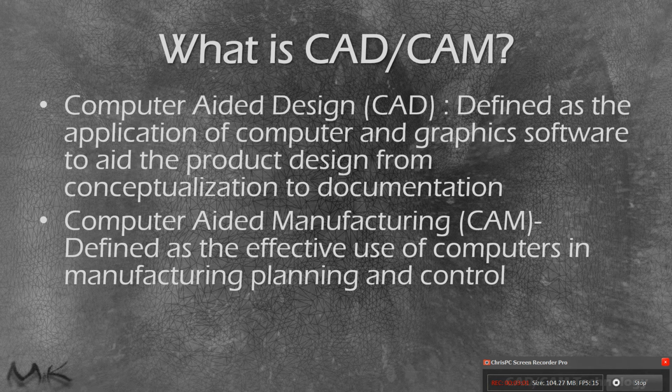So it can happen in two different ways, right? We can have additive and subtractive methods. When we look at our subtractive methods of CAD/CAM, that's more along the lines of our in-office milled restorations. When we start looking at additive types of restorations, that would be something along the lines of 3D printing.